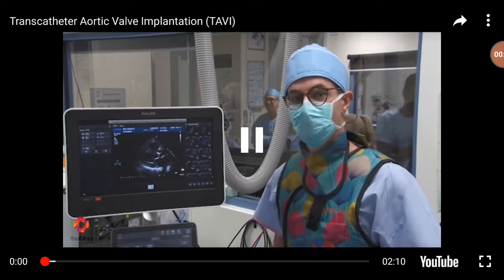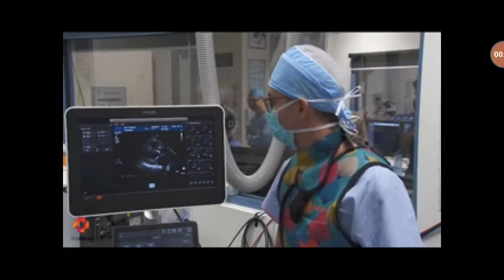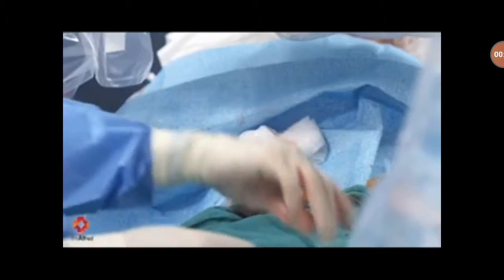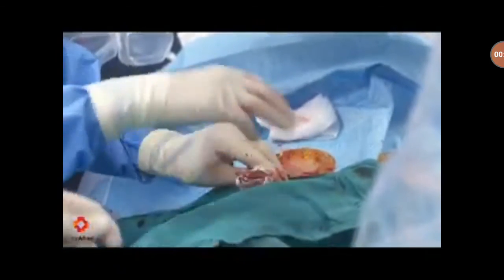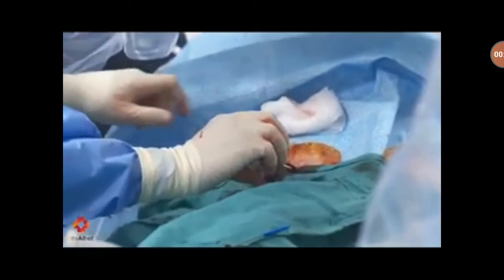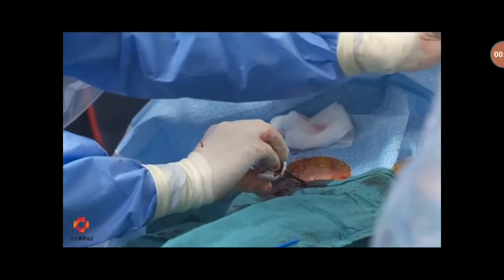First thing that we can see is the severely calcified aortic valve with restricted opening. We can also establish on this picture that there's probably moderate LV dysfunction. We're now going to pull the system back out of the artery and retrieve those sutures. We're going to make sure that we get the whites and the greens opposite to each other.